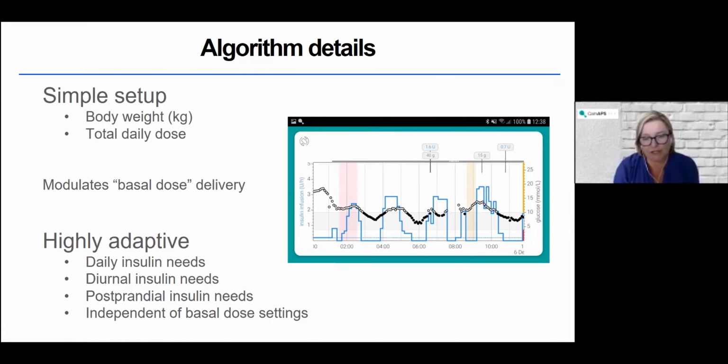graph that we've got here that you can see modulates very clearly according to the direction of travel that the glucose is going in, and can quite quickly respond and control and improve time in target. It takes about 3 weeks after starting the system to really hone and learn about the individual. So it's very adaptive. We all know from people living with type 1 diabetes that no one day is alike.